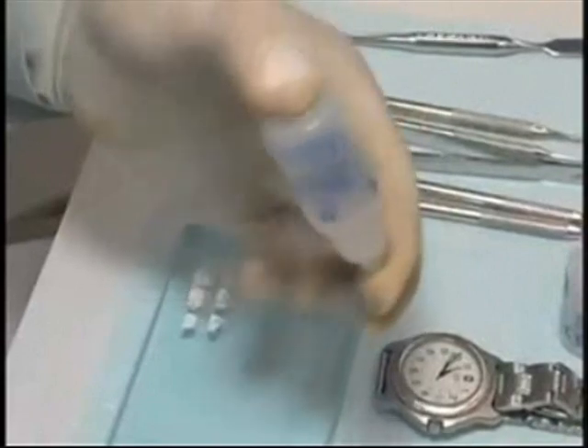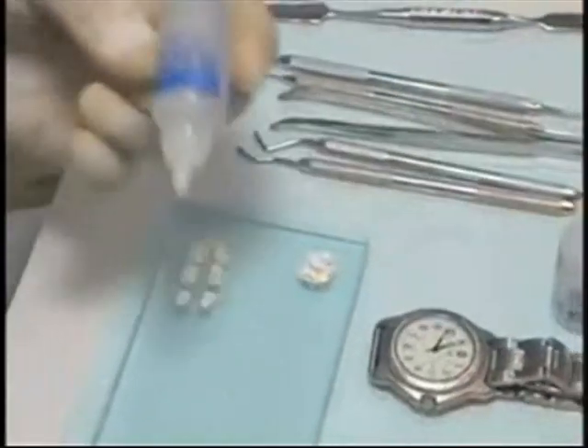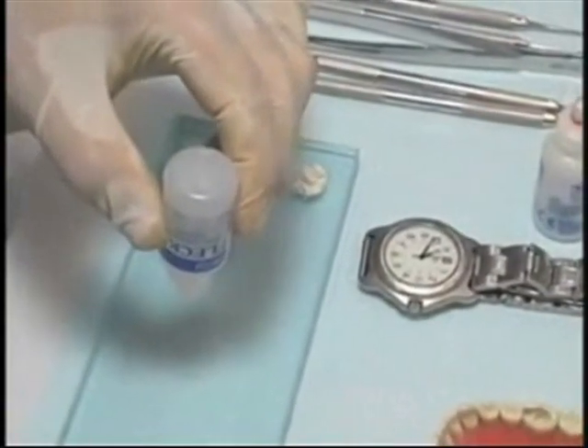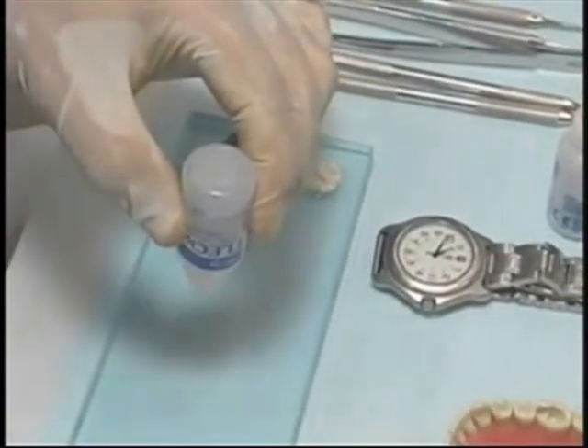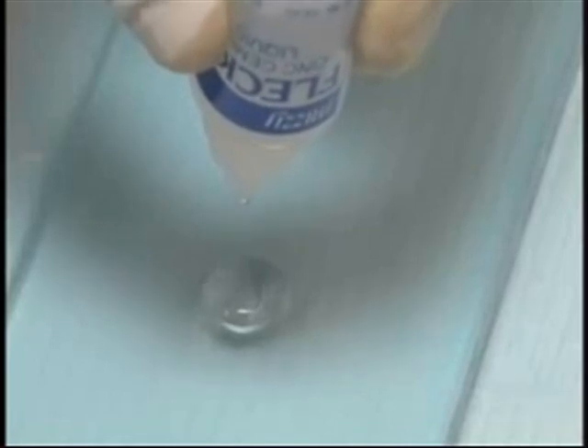Swirl the liquid bottle before dispensing six drops of liquid onto the center of the slab beside the powder. Keep the orifice of the dropper perpendicular to the surface of the slab. Dispense six drops: one, two, three, four, five, six.